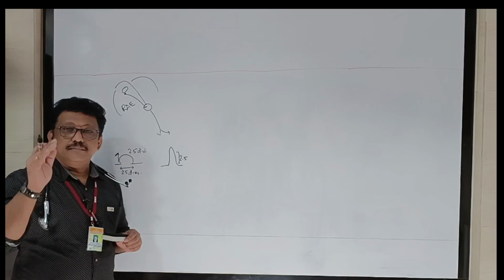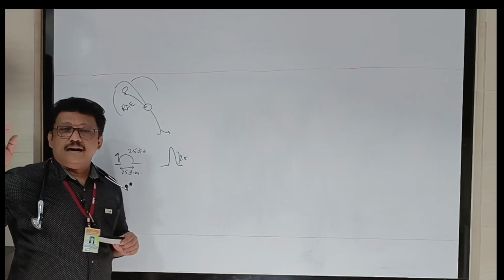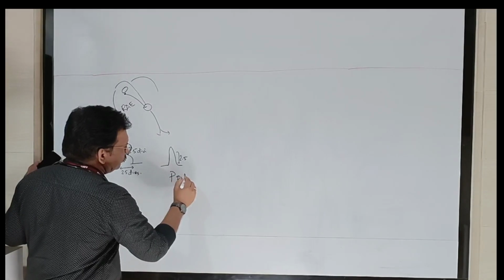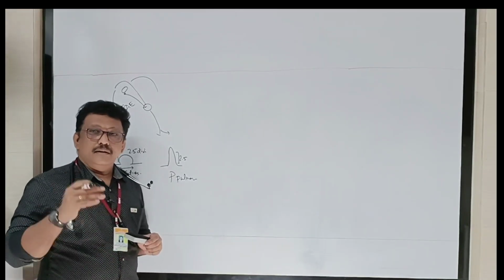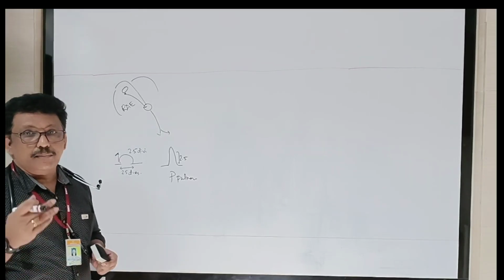You can remember: a peaked P wave is called P pulmonale, classically seen in cor pulmonale. It is mostly related to pulmonary diseases like COPD, ILD, or any acute lesions like pulmonary embolism.